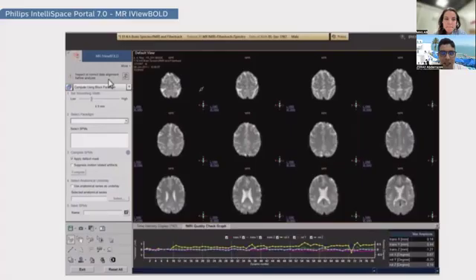Usually we have the T1 as a reference, and we have the 3D gradient echo for the reference. This is what we use to underlay in the image. But when we use a paradigm, like language, like motion, and like talking, we use the fast field echo with echoplanar imaging as a fast mode imaging.